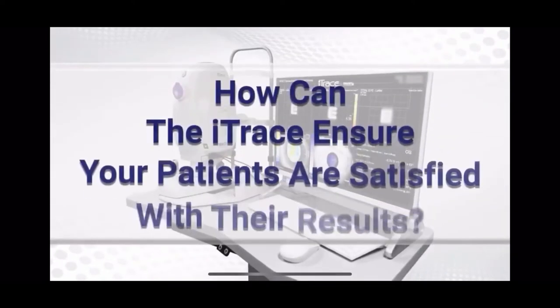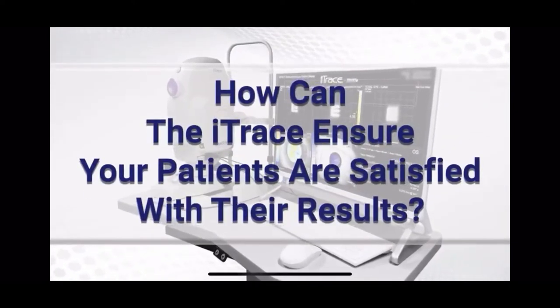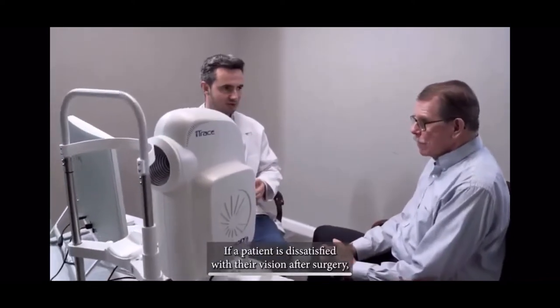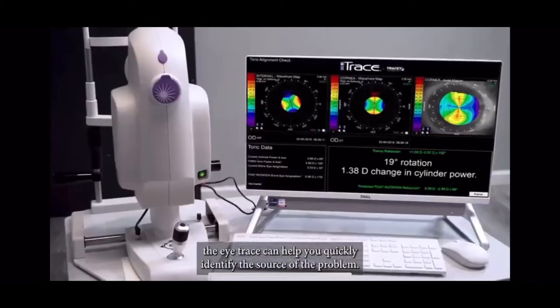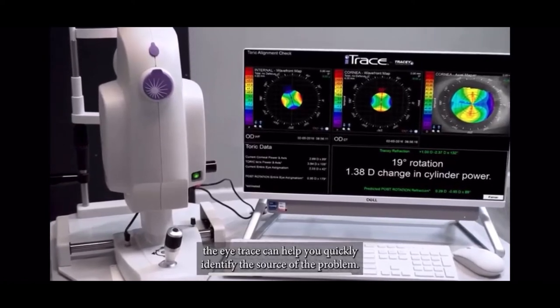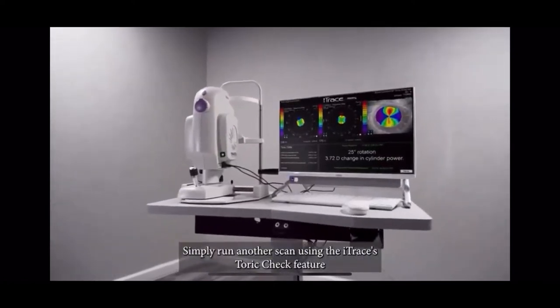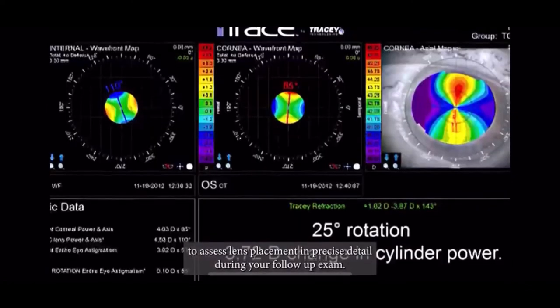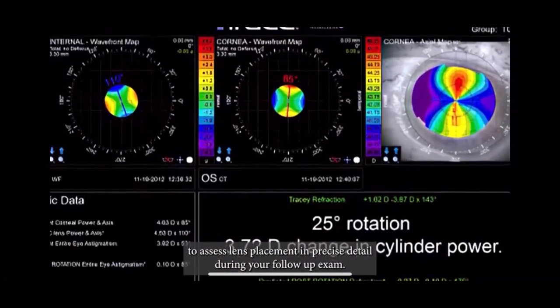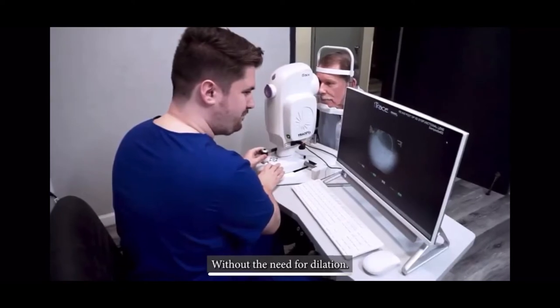How can the iTrace ensure that your patients are satisfied with their results? If the patient is dissatisfied with their vision after surgery, the iTrace can help you quickly identify the source of the problem. Simply run another scan using the iTrace's TORIC check feature to assess lens placement in precise detail during your follow-up exam, without the need for dilation.